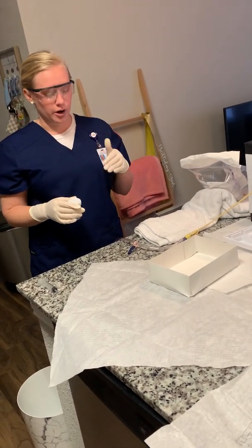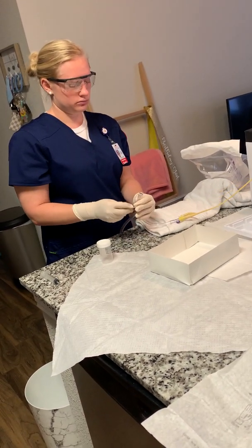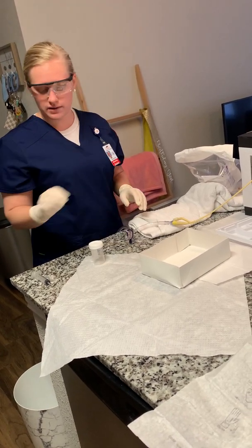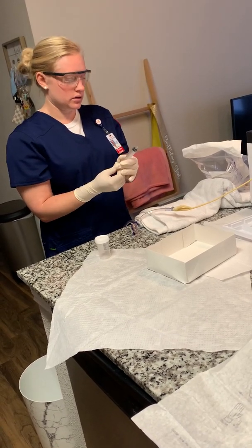And then if I want to get a specimen collection a couple of days after inserting the catheter, I would do that at the port. So first I would need to kink my tubing like this, and then I would get a syringe and make sure that it works properly.